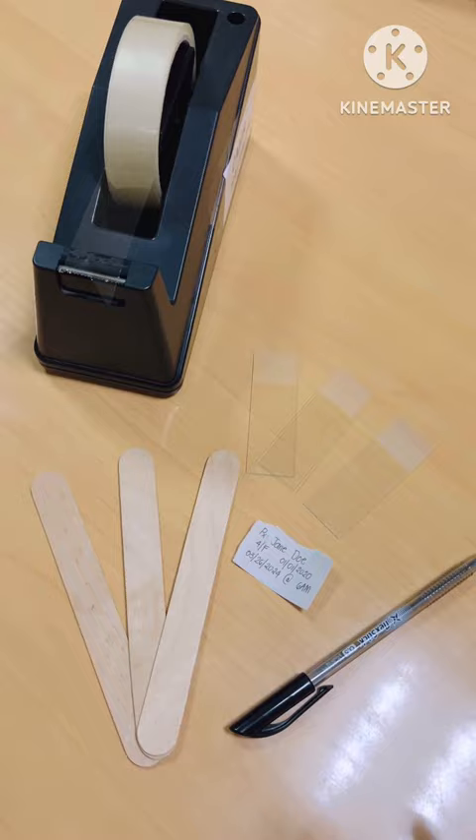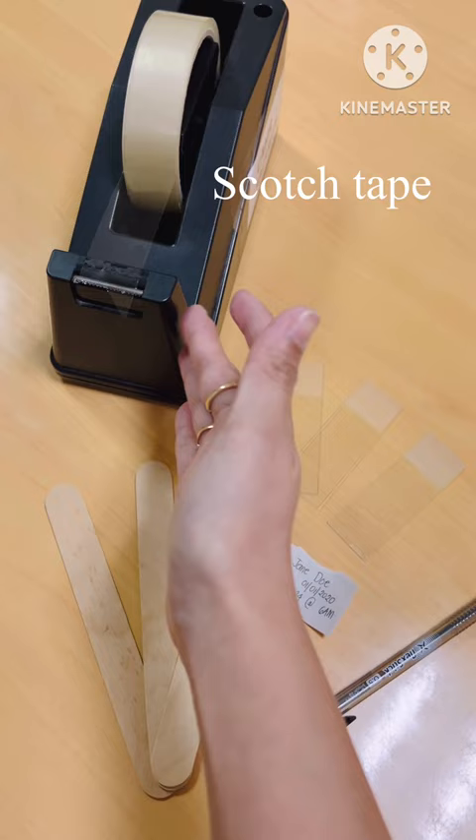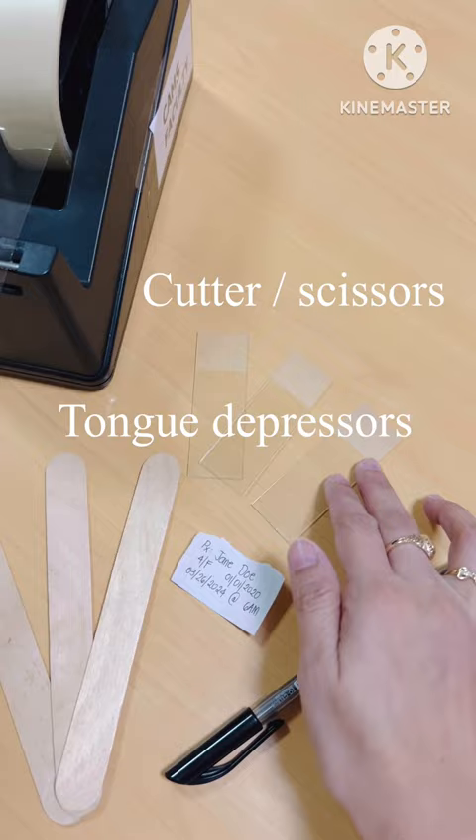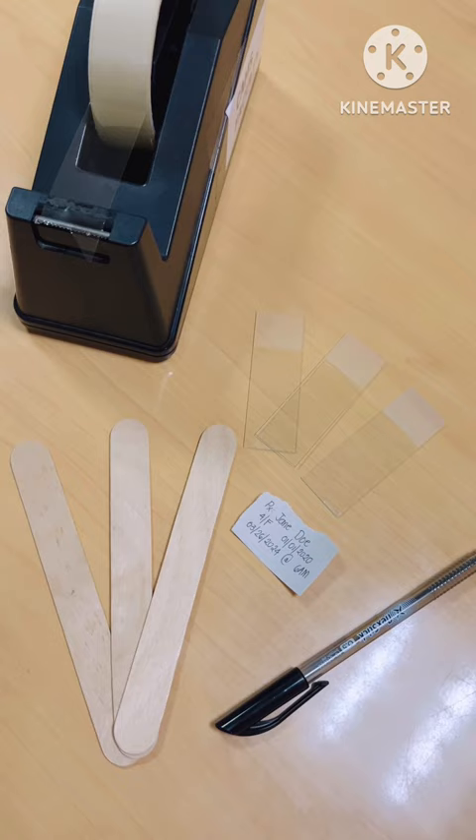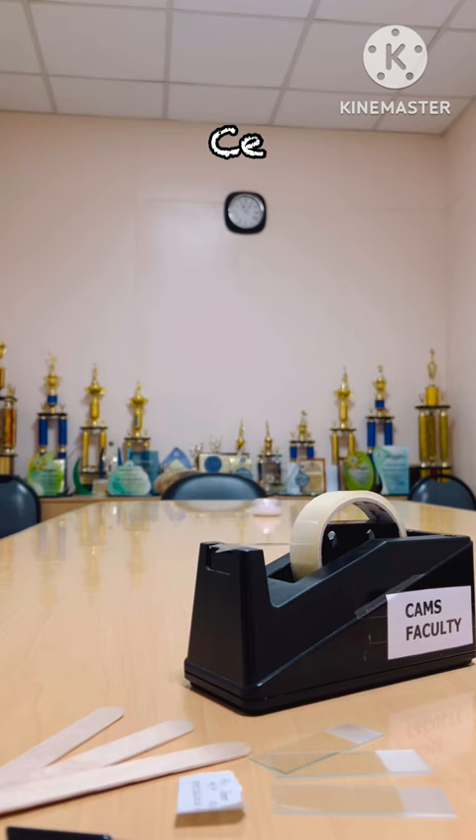In order to create a cellulose tape perianal swab, these are the materials that are needed: a scotch tape, a cutter or scissors, tongue depressors, clean glass slides, a ball pen, and paper for our label. It's very important to have a sturdy type of paper for our label to avoid scratching or tearing it.